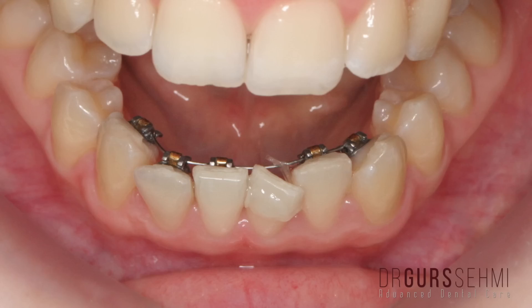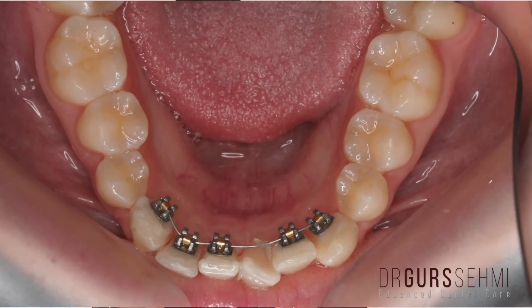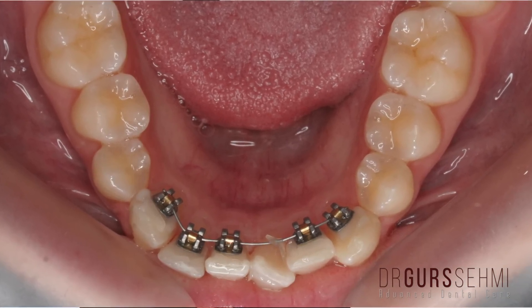Now if you've done a lot of research you'll probably find out this is actually one of the most expensive braces you can have, but because we're only doing a few teeth at the front we can actually bring the cost right down, so there's not a lot of difference between this and a brace on the outside.